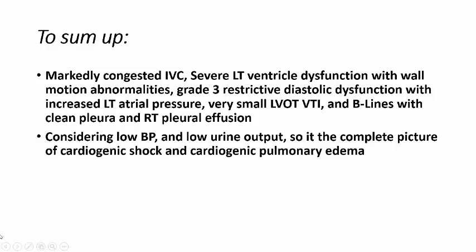edema. It's very clear. By these very important target views, you target the lung, you target the inferior vena cava, you target the heart by advanced critical care ultrasound. In a couple of views, you reach a complete picture. You have the bad left ventricle, the high left atrial pressure and the B-lines in the lung. No doubt, this is very important in diagnosing cardiogenic shock and cardiogenic pulmonary edema.